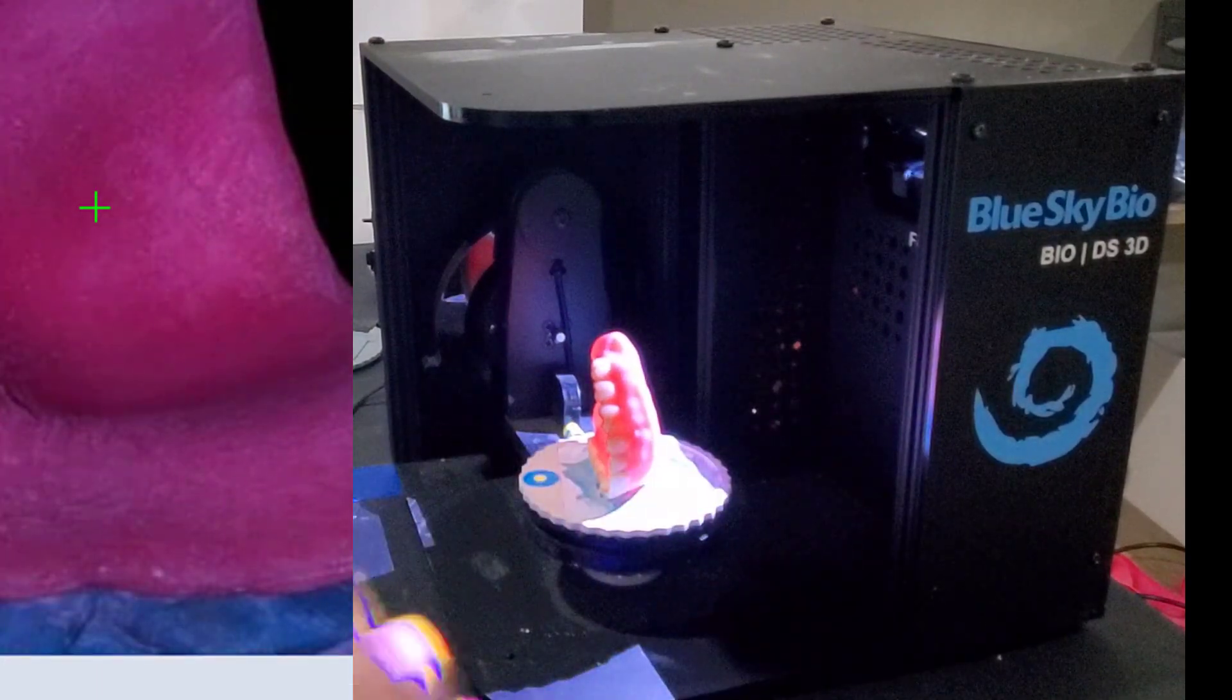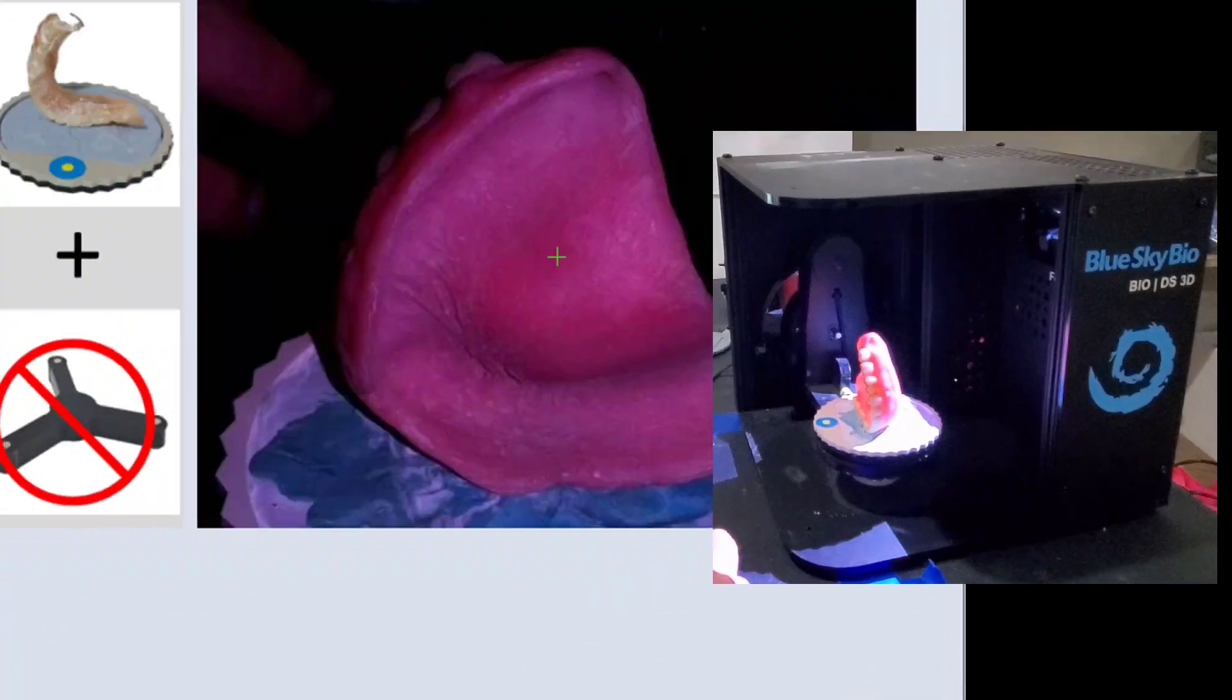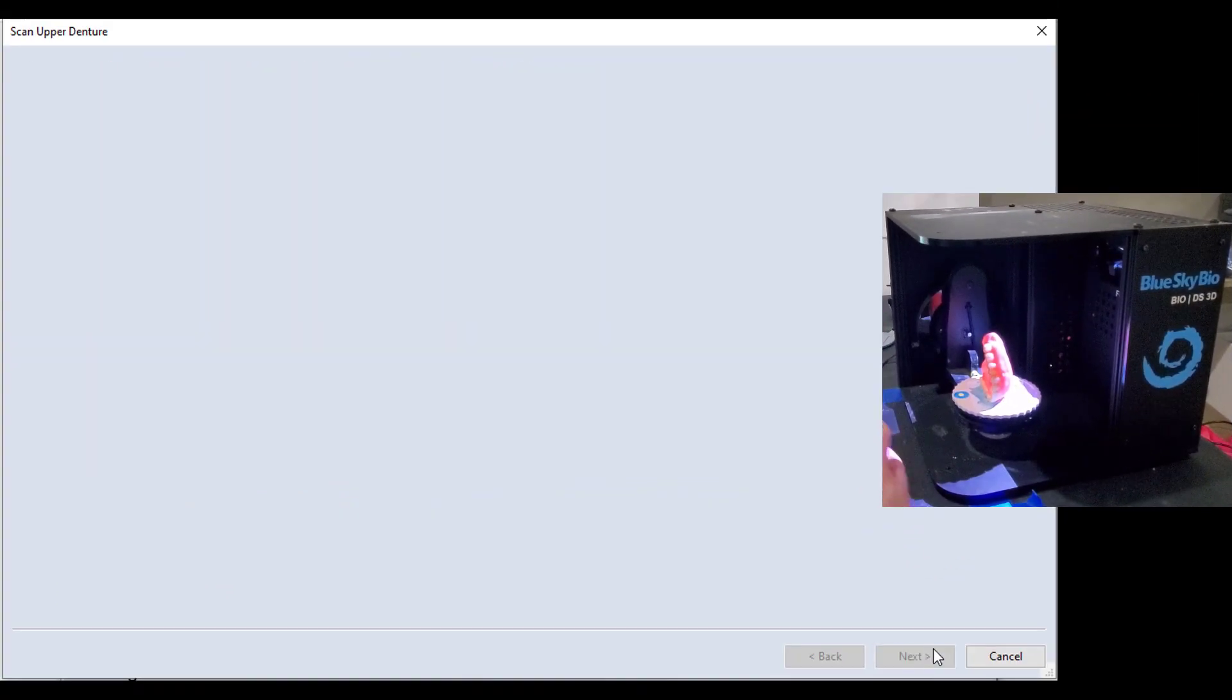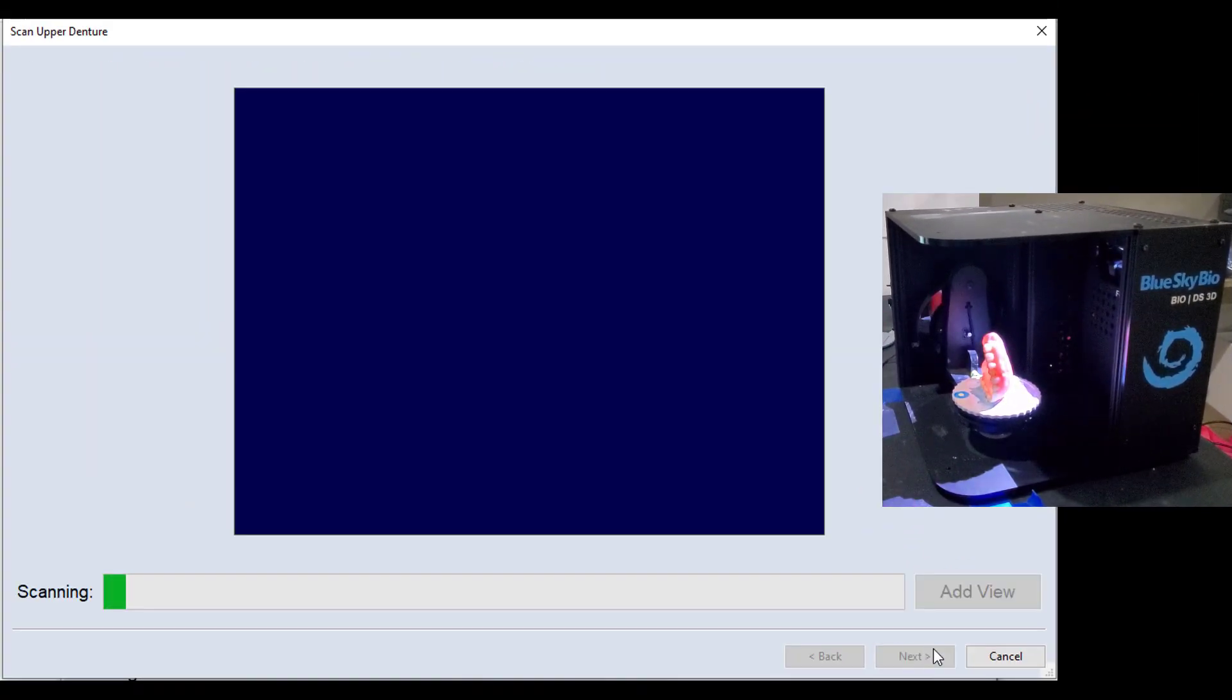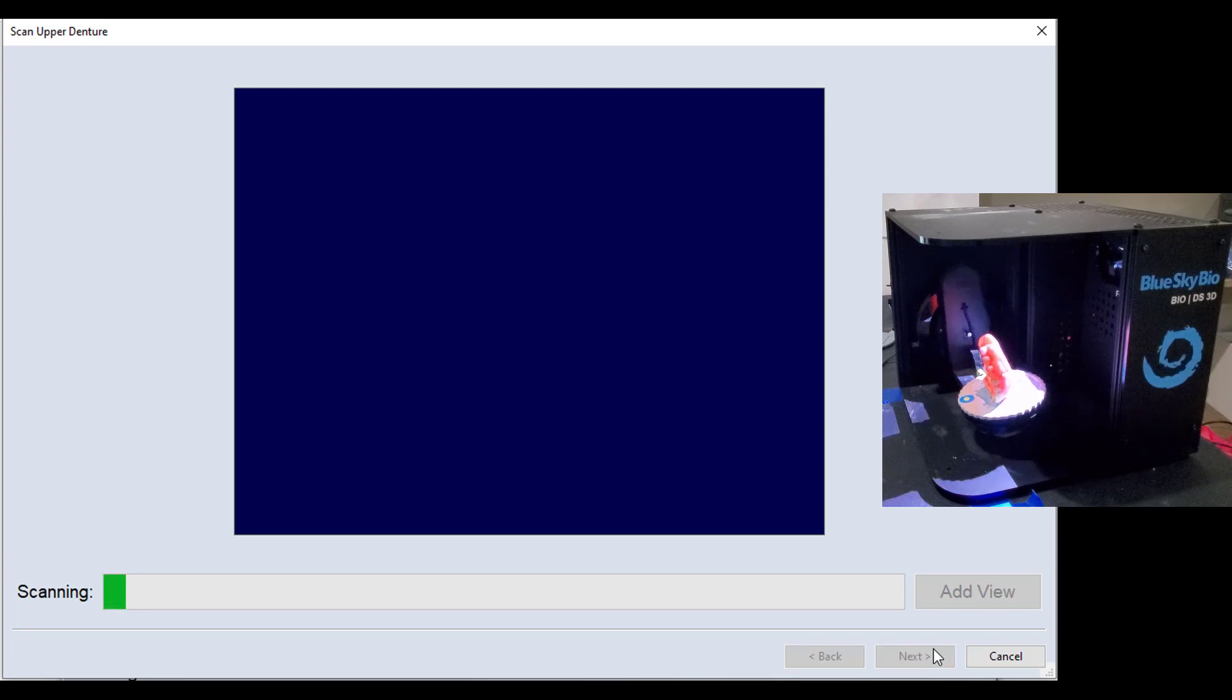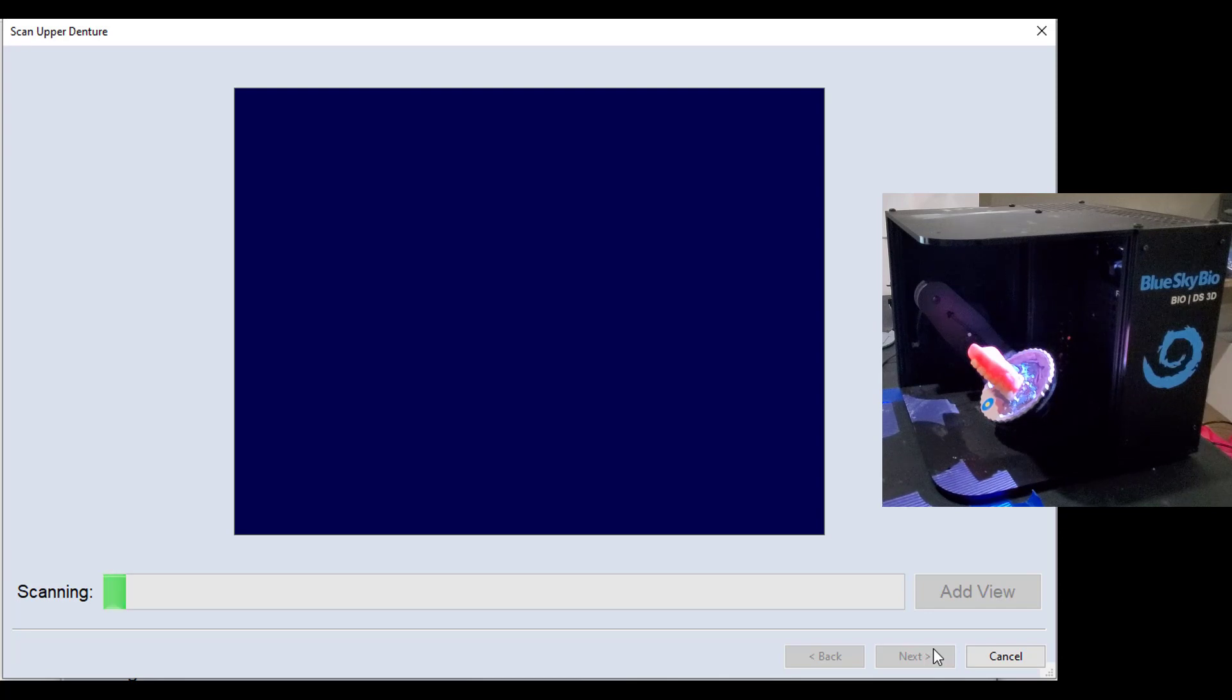And now we're ready to go ahead and click next. So now the scanner is going to begin taking some pictures, and I'll time lapse this so that you can see it, but it's just going to take pictures from many different views, and then it's going to have us flip it halfway through.